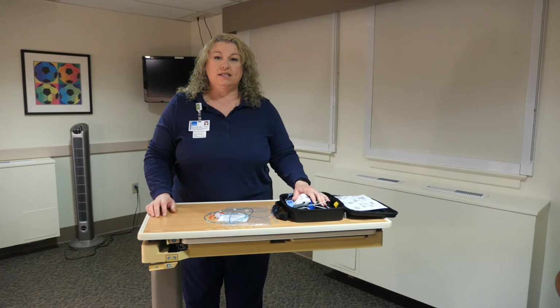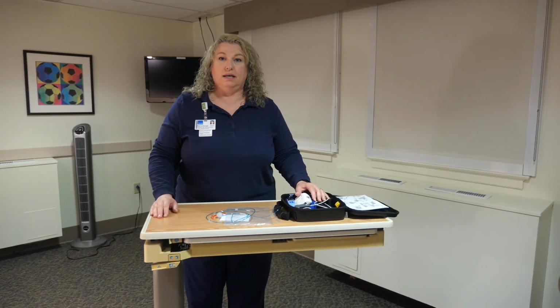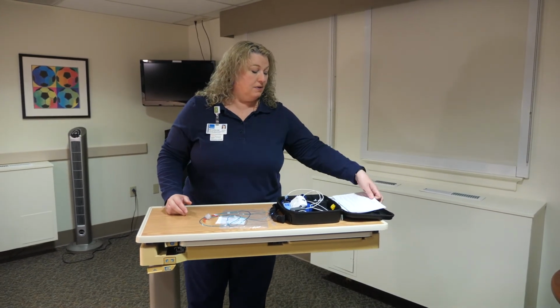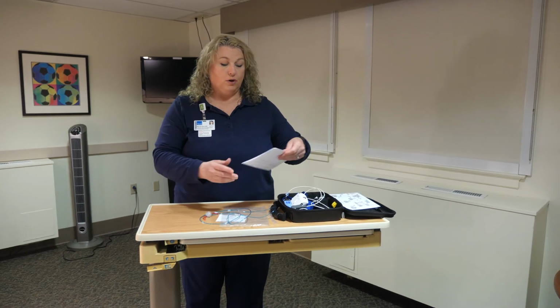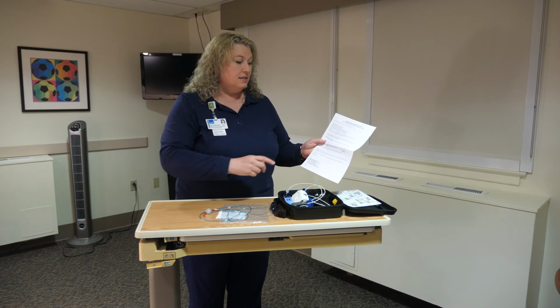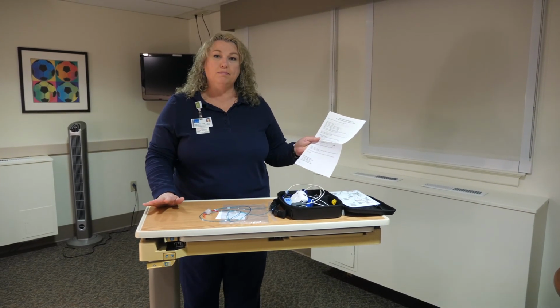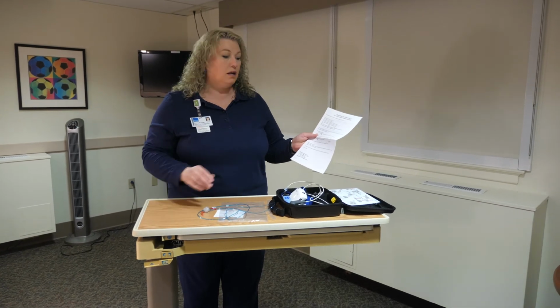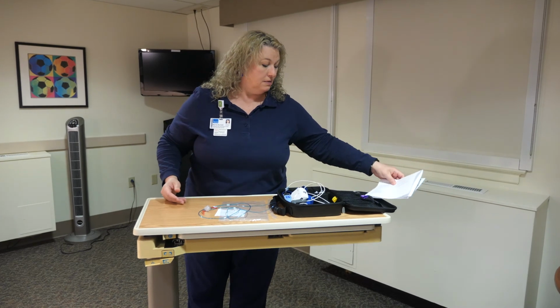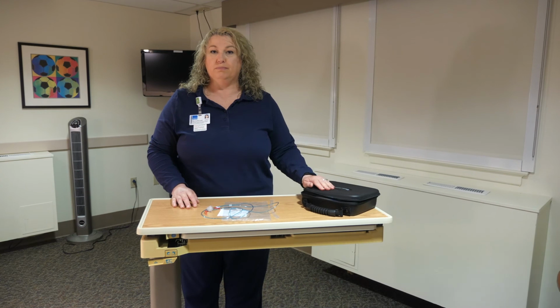You should return the device at your regional medical facility where you saw somebody to get instructed on how to be set up. The cannula goes in the garbage. In the back of the kit in the pocket, there will be a post-study questionnaire that we'd like you to fill out. So just take a couple of moments. Simple things like letting us know when did you go to bed, when did you fall asleep. I know that can be subjective, just do your best. Complete the questionnaire and then put it back into the kit along with the instruction card. Zip it up and you've completed your sleep study.